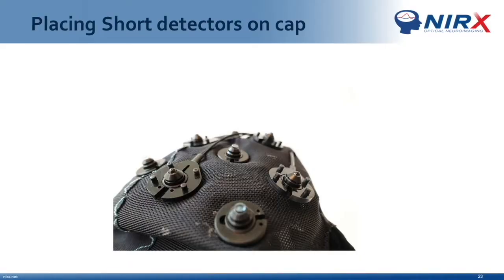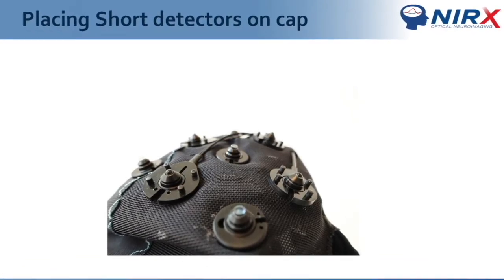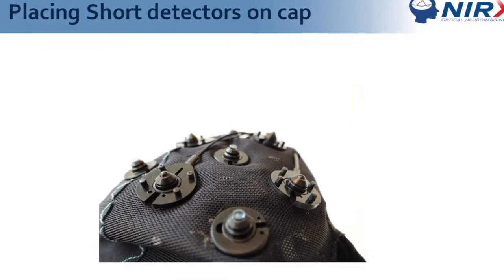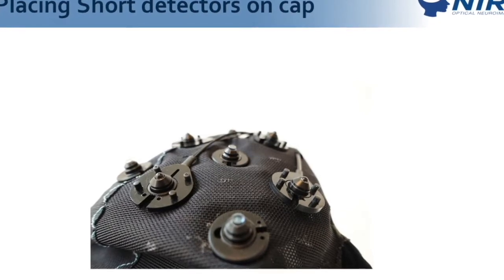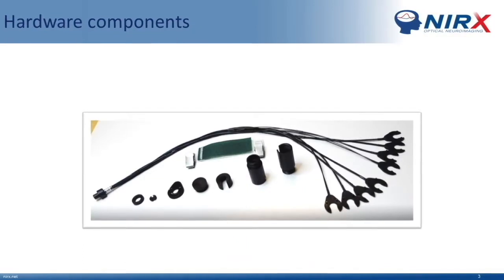The next step would be to place physically the short detector clips in the cap. And for that, I have a video showing how to place them. We'll see the video, and in the meantime, I will talk about what's happening in the video.